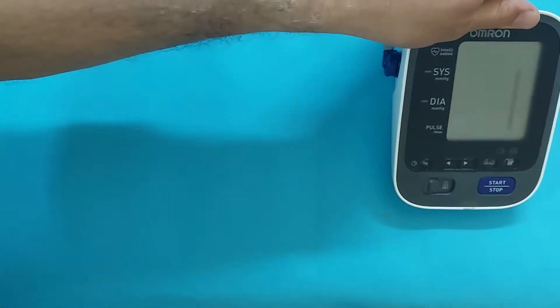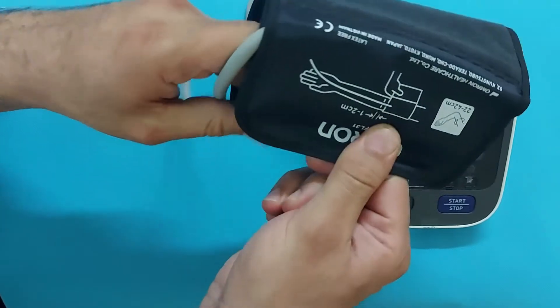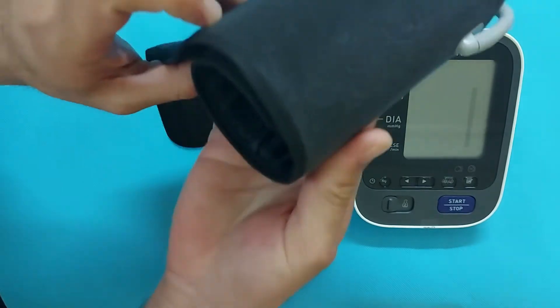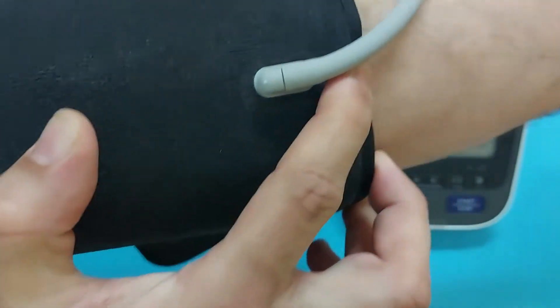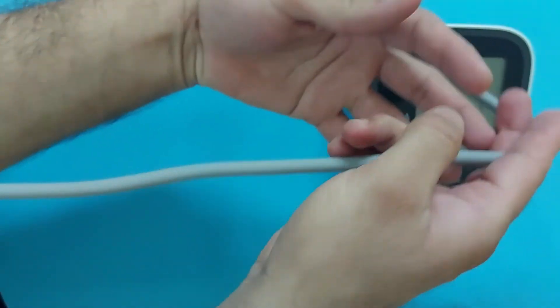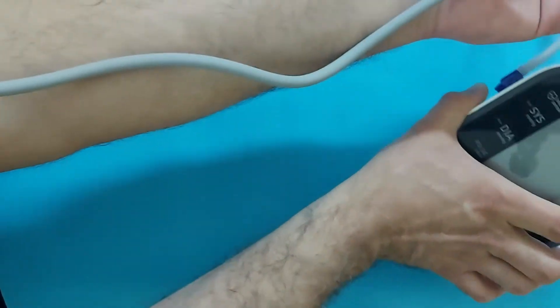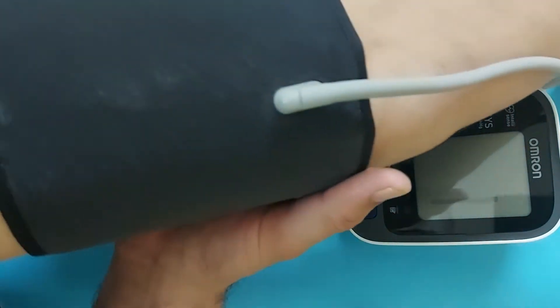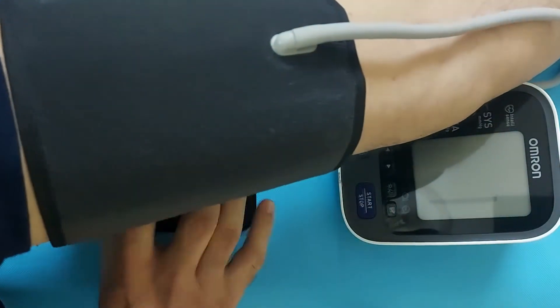Let's start measuring blood pressure with the left hand first. Take the arm cuff and wrap it around your left arm. Make sure to keep the tube in the middle of your hand — hold it in the middle of your fingers. Keep the arm cuff above your elbow by at least one to two centimeters. When I fix it, I will make sure it is above the elbow.